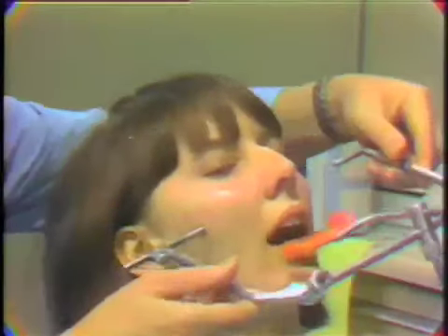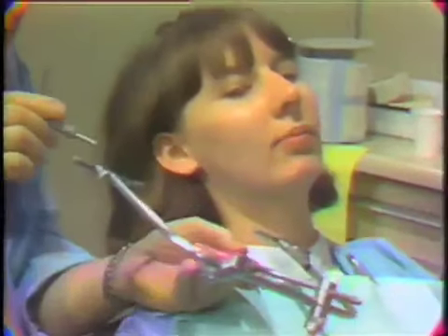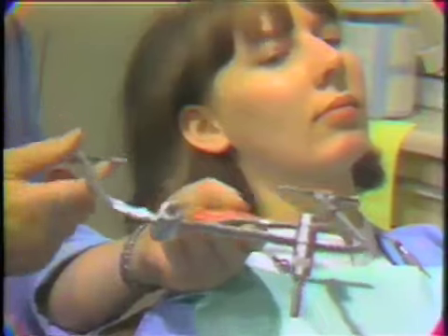Open, please. And what we're doing in reality is transferring the relationship of the axis to the maxillary cast as we mount this on the articulator, so that they are oriented the same on the articulator to the axis as they are in the patient's head.